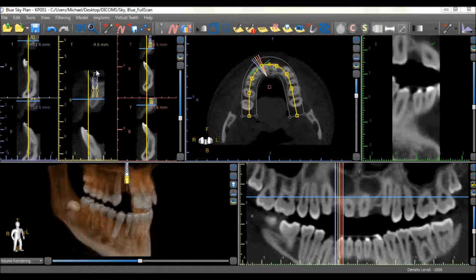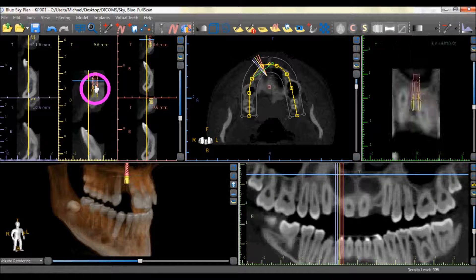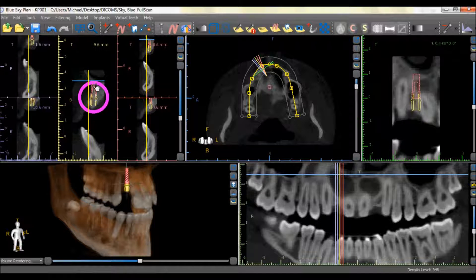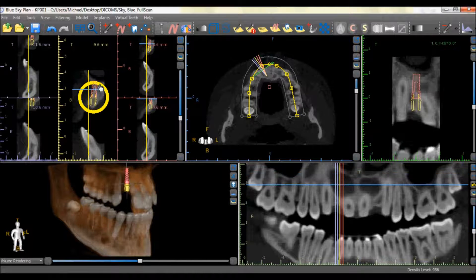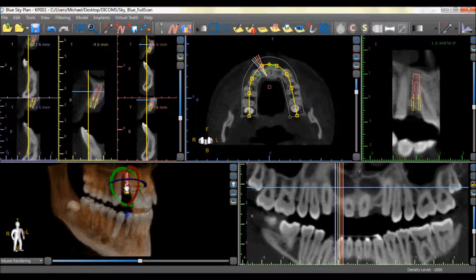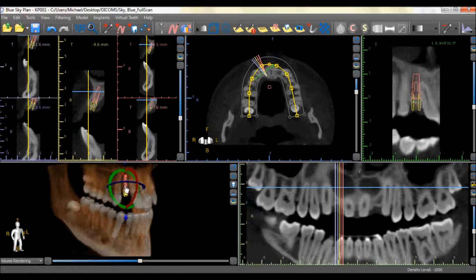The implant can be moved by using your left mouse button to grab and drag the implant. The angle of the implant can be changed by grabbing the circle around the implant and dragging it. The implant location can be modified in the 3D view as well and rotated or moved in any direction.